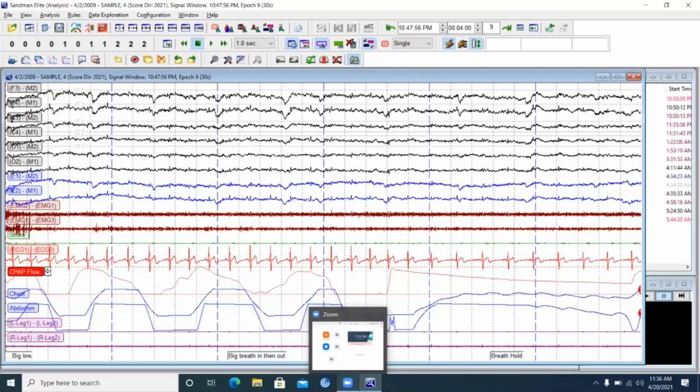It's really easy to get caught up fixing things or getting your paperwork set up. Usually I tell them to hold their breath for a slow count of 10, because if you tell them to hold their breath for 10 seconds, they usually hold it for 3, because nobody really knows what 10 seconds is. Sometimes patients will think a slow count of 10 means 30 seconds. So okay, it's all right.